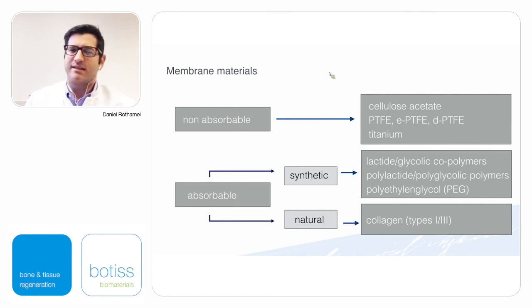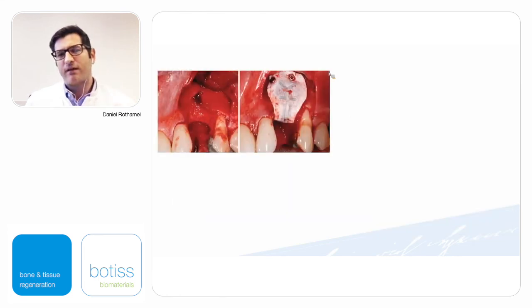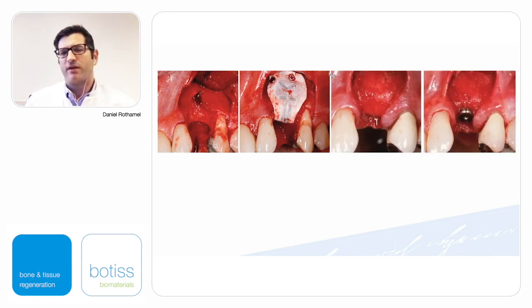The idea of GBR procedures does not require bone substitute material. In this situation, after the application of a titanium-reinforced ePTFE membrane, there's just enough space and enough time for the bone to regenerate, and there's beautiful bone formation at the end of the healing period.